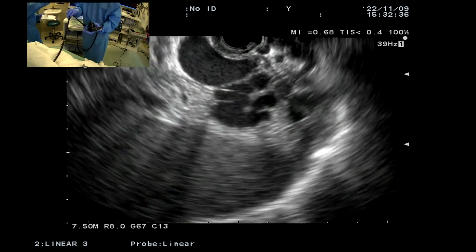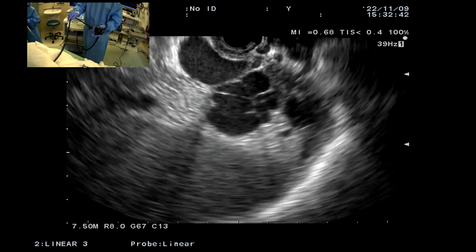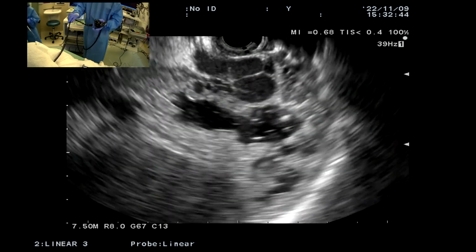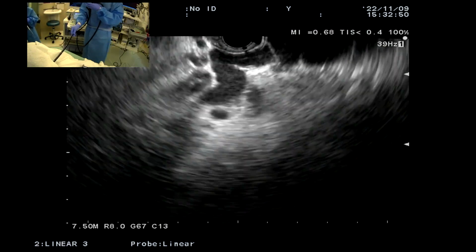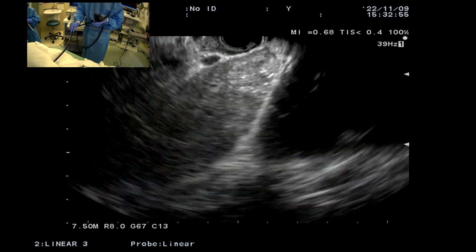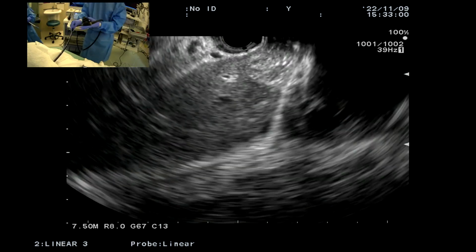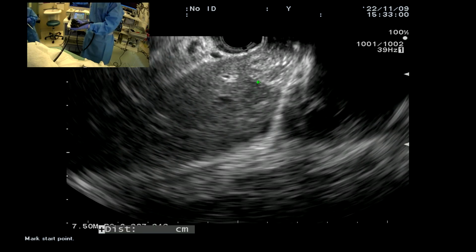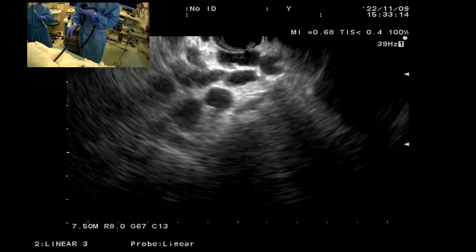So now it's a question of bringing my scope into a position that is a little bit more assistant friendly. And so I'm going to slowly rotate like this. Interesting that here on the liver, you can see this echogenic nodule there in the left lobe at the tip, which we'll just make note of in our report. Of course, these patients are at increased risk of HCC, but that's probably just an area of fat accumulation.